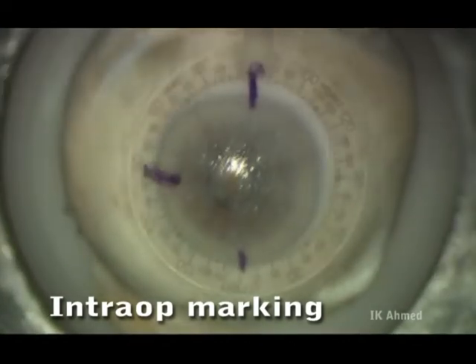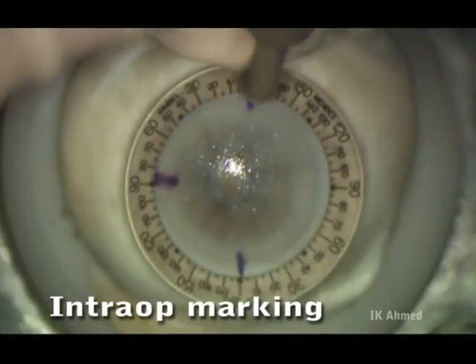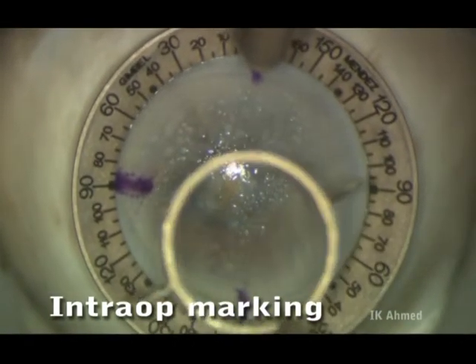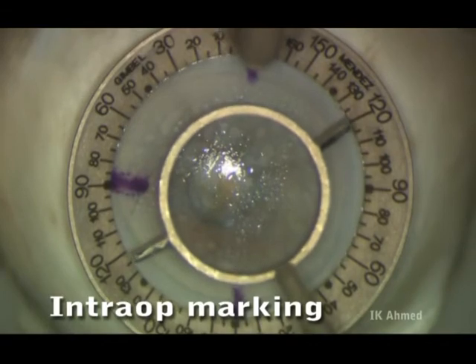Here we're preparing a two-ray marker which will be used intraoperatively with a graduated ring to mark the axis of astigmatism, using the three pre-op marks as a reference point.